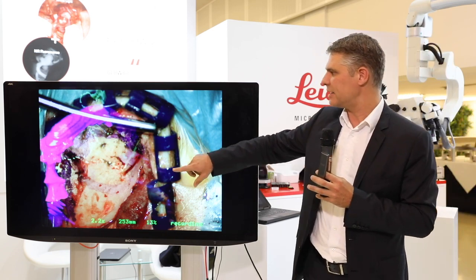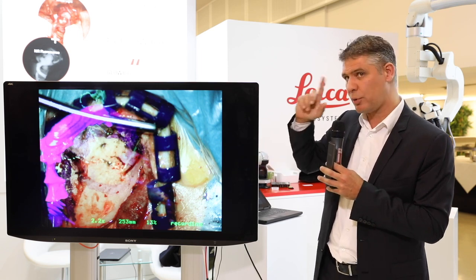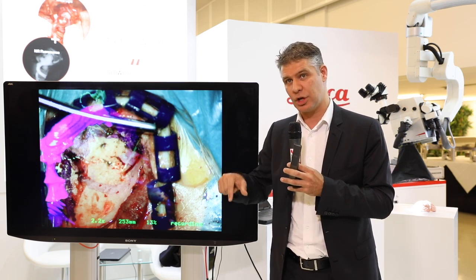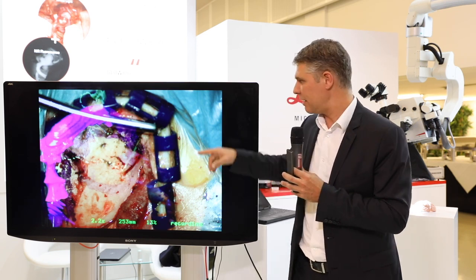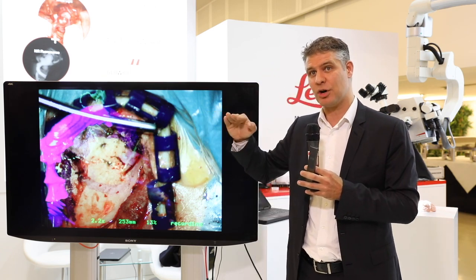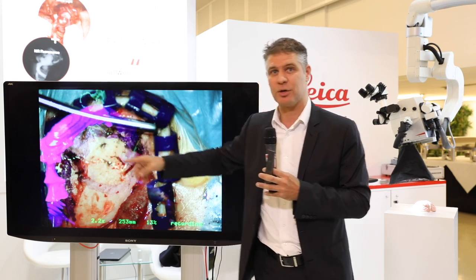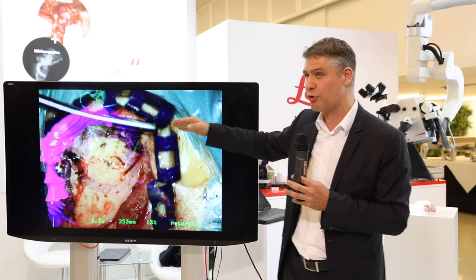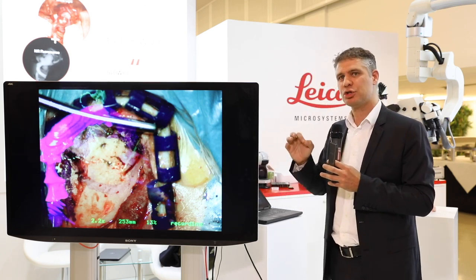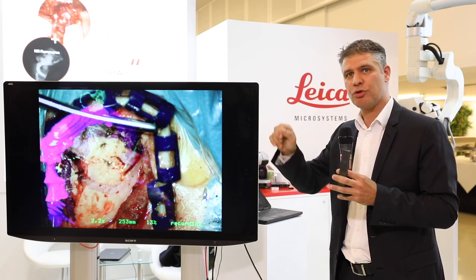Be careful with this image — there is parallax. The sinus is actually below the skull, so it's deeper. If you change your trajectory, the projection on the surface of the bone changes. We draw the sinus here, and you see it is shifted because we changed the trajectory of the microscope between the drawing and the picture. It is very important to have a recorded trajectory where you align all your projections — as soon as you change from that, all your drawing shifts.